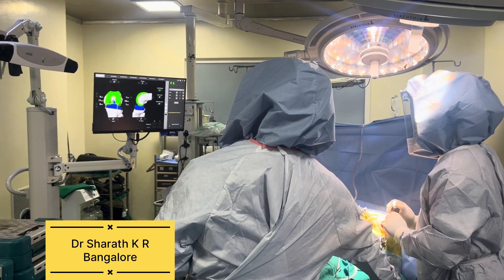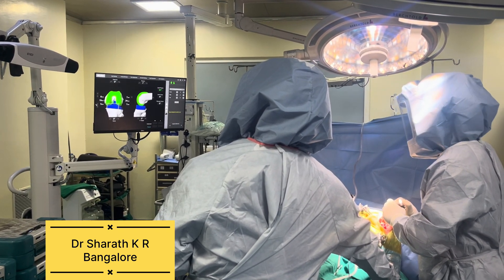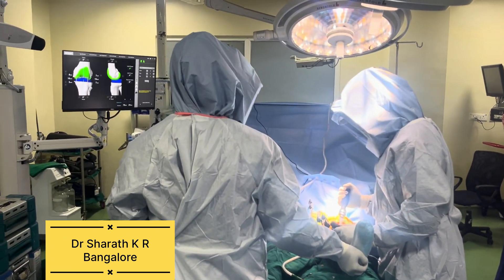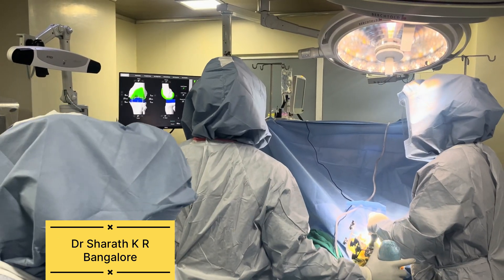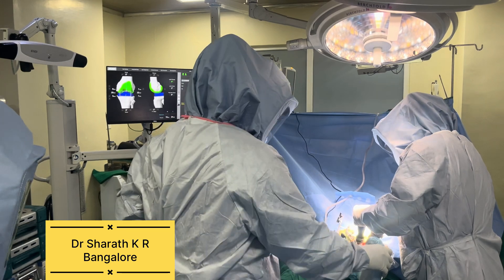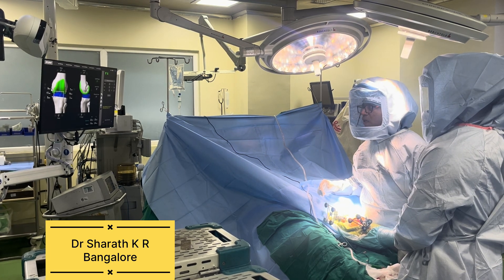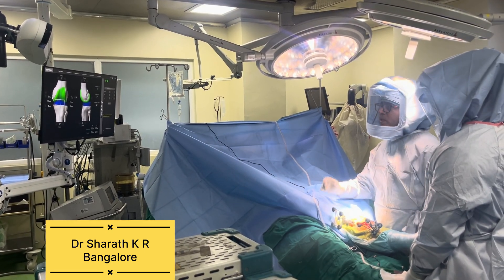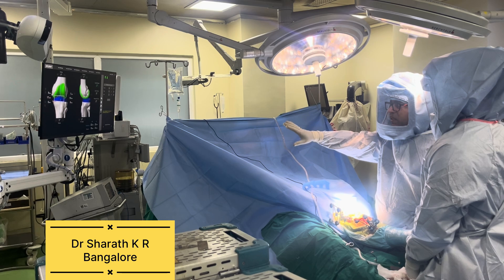Gap measurement means we will be checking the gap of the knee joint in bending position and straight position. Bending is the flexion position, measured at about 90 degrees of bending, and straight position is about 0 to 20 degrees. We keep something like a spoon or an osteotome and spread the knee to assess how much is the inner side opening and how much is the outer side opening. The goal of this total knee replacement surgery using the robotic assisted procedure is to ensure perfect and equal balancing of the knee in the medial and lateral — meaning inner and outer parts — in both bending and straight positions.